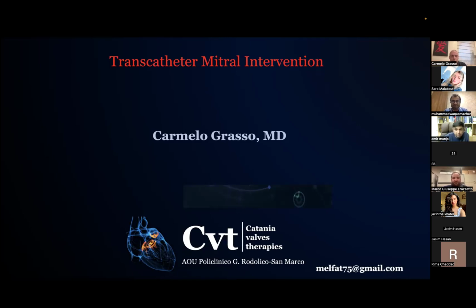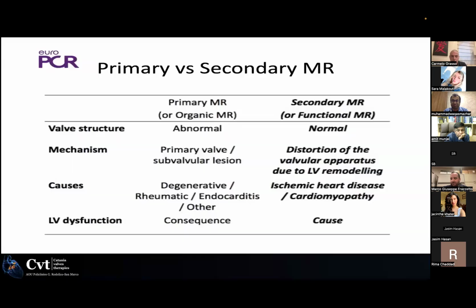I will try to give you an overview on mitral regurgitation and what to do when we talk about transcatheter mitral intervention. So we start from the beginning.